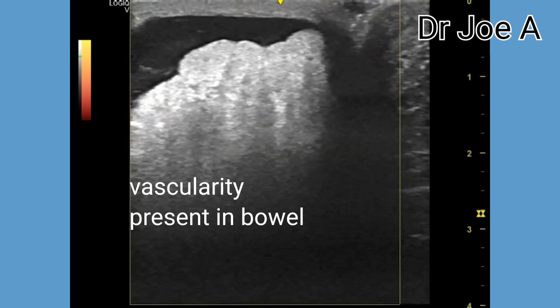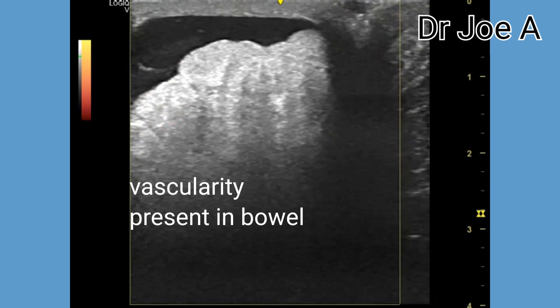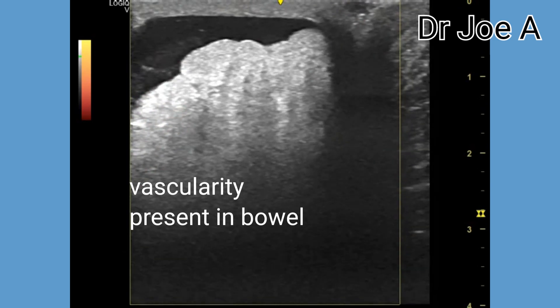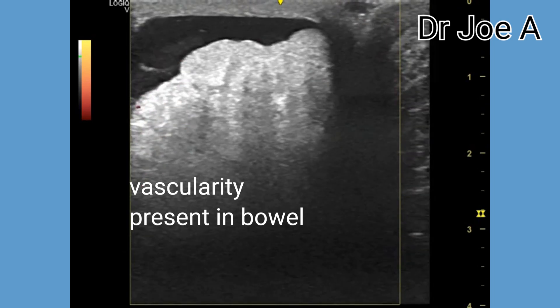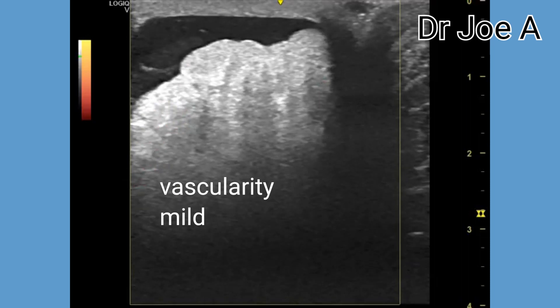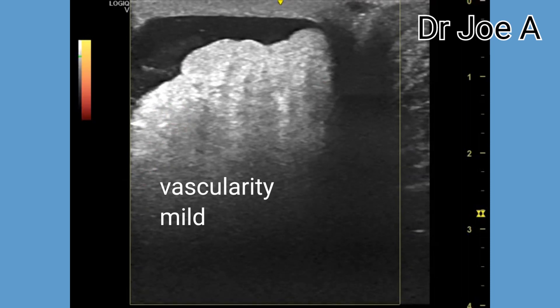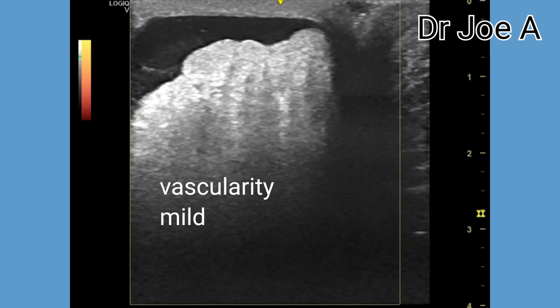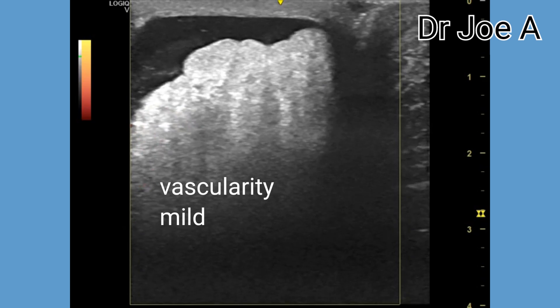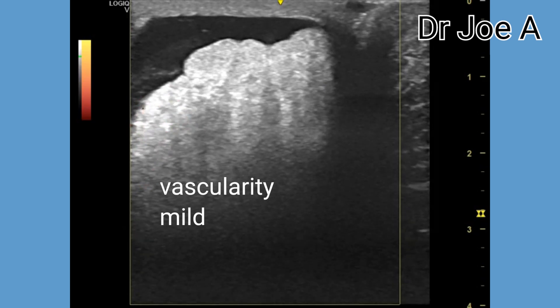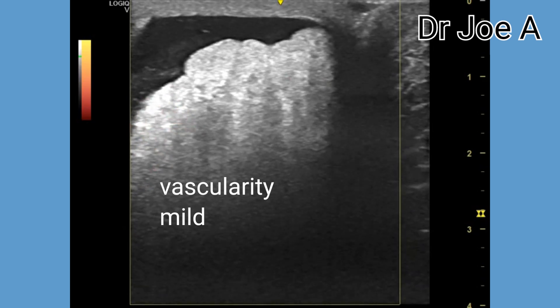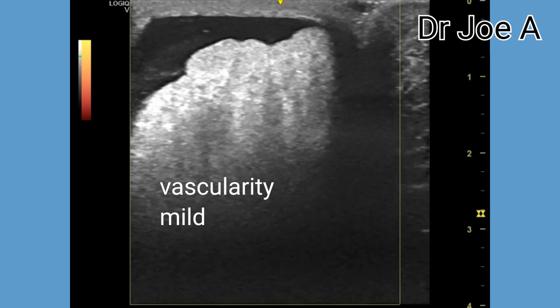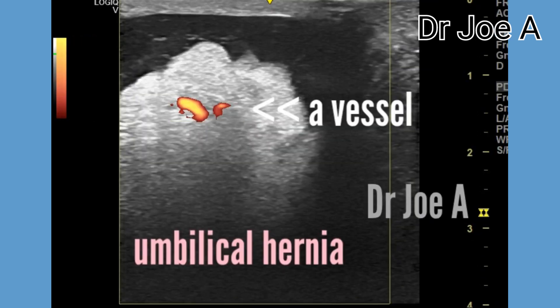In this patient, the presence of blood flow within the hernial sac is suggestive of lack of incarceration or strangulation. Thus, though there is a danger of strangulation, at present there is still a suggestion of a good prognosis.